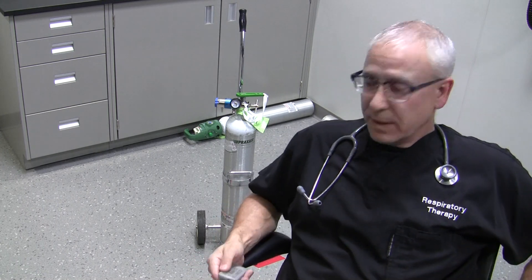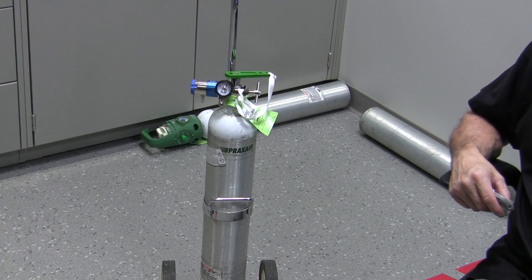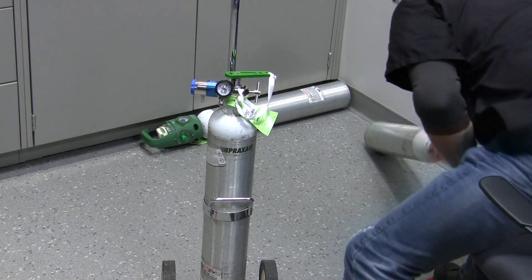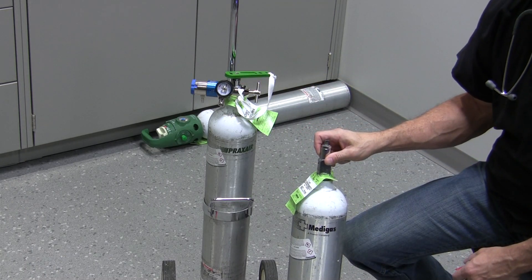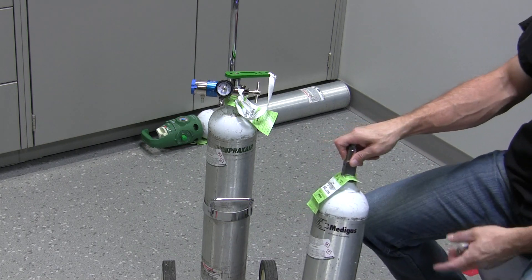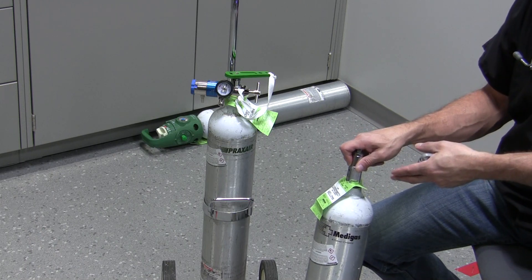If we look at the cylinder behind me, this is your typical cylinder that you might see out there — a cylinder by itself, like this one here. What we've done is we've attached an oxygen regulator to it. Oxygen regulators are meant to go on oxygen cylinders, air regulators on air cylinders, nitrous oxide regulators on nitrous oxide cylinders.